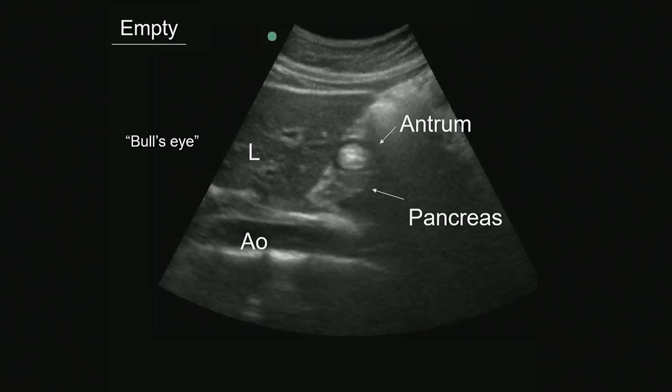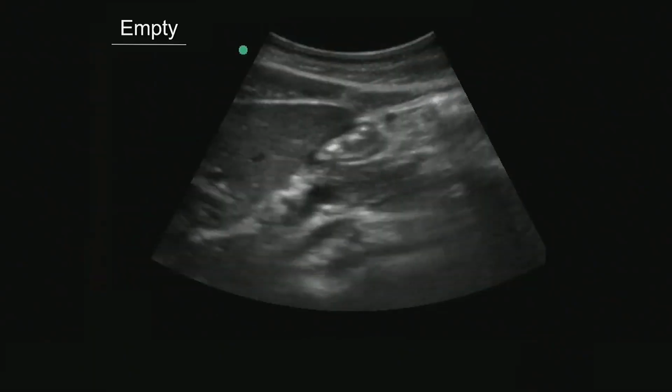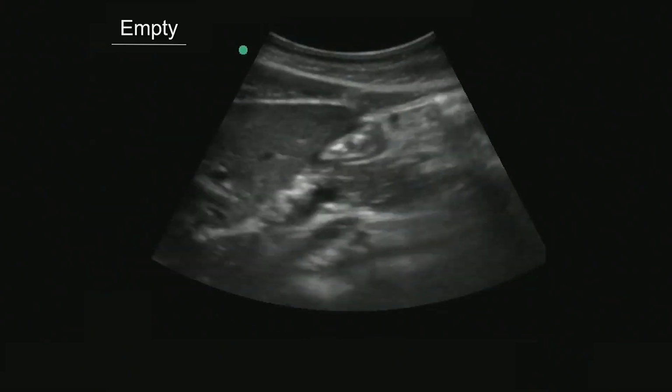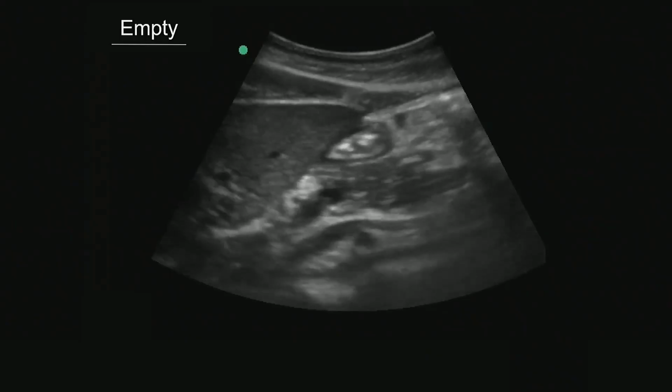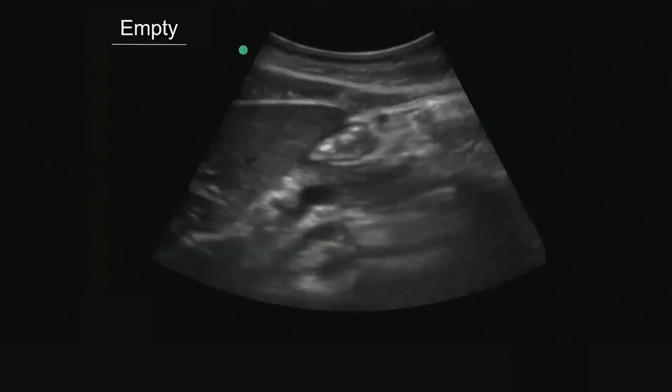This is a picture of a small empty stomach, you have invaginations, and that's why you see it white. More dynamic, in which you have a little bit of lumen with black fluid. 50% of your patients, pregnant and non-pregnant, will have some fluid in the stomach. So the concept of an empty stomach is not there. 50% have some fluid. We'll talk about that as well.